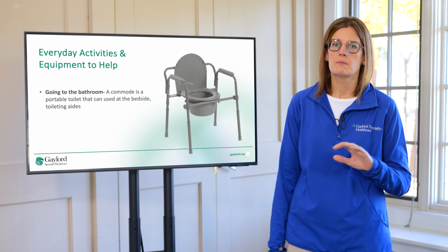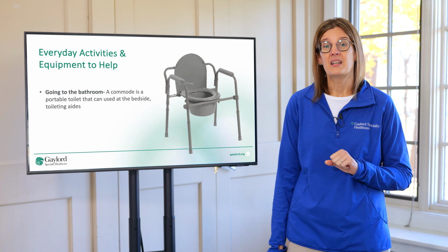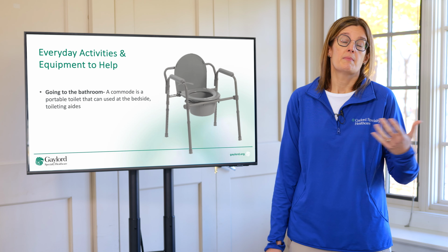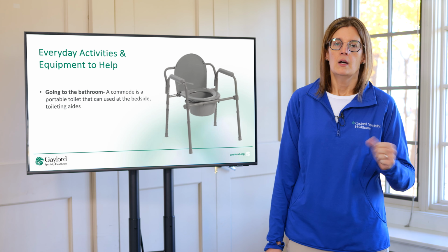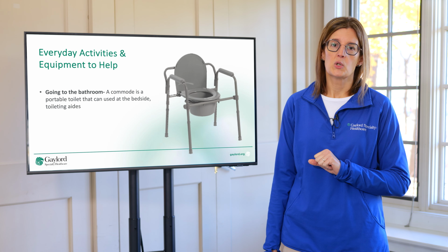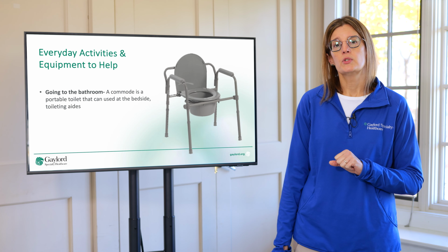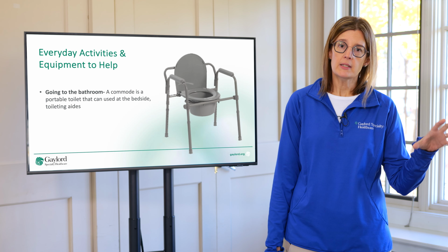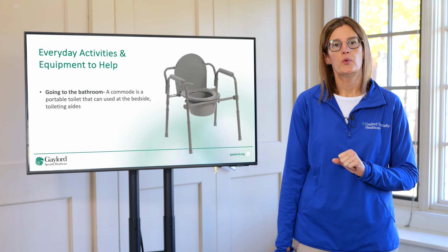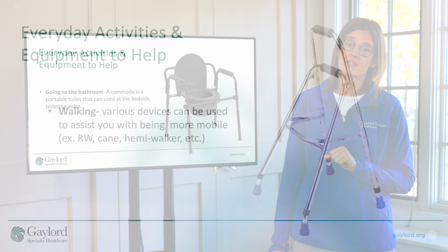As adults, we're used to being able to take care of that function without assistance. And so being able to go to the bathroom, even just from an upright position, is a goal for many, and not all are achieving that, given how the stroke has impacted their mobility. And so being able to use a commode is an important tool, and one that can certainly be placed over a toilet, right, and or bedside, which can be helpful for our stroke survivors in being able to get to that goal sooner versus later.